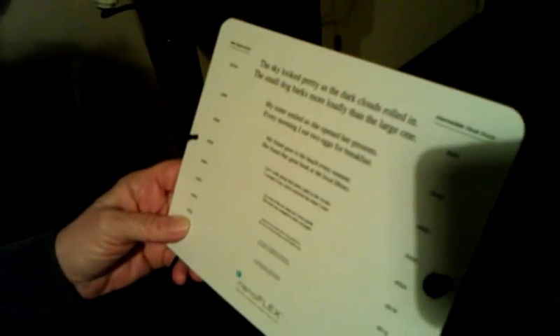Now I have you — you have a reading card in front of you. Without glasses, can you read? Let's go to the top. Can you read up there? 'The sky looked pretty as the dark clouds rolled in.' 'The small dog barked more loudly than the large one.' And what's the lowest you can read there?